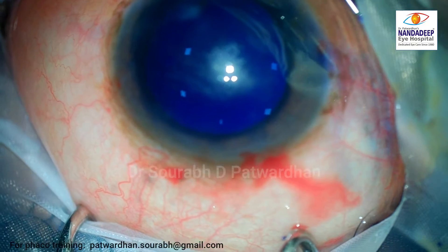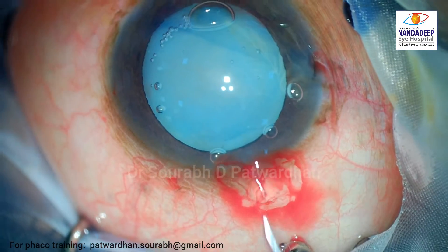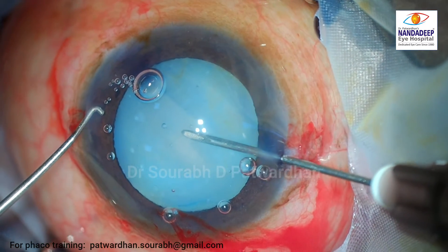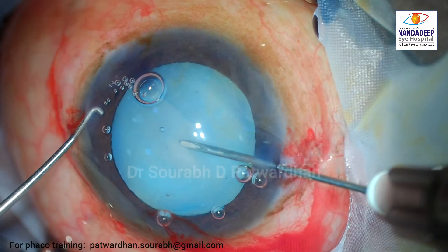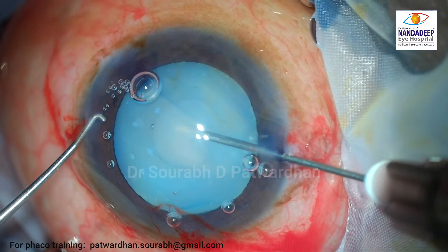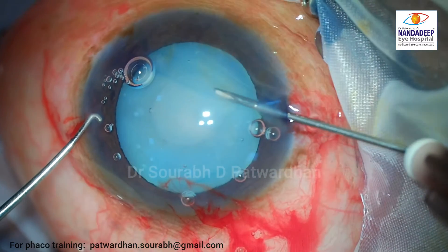As you can see here, the angle between the main incision and the left side port incision is around 100 degrees. Then the heavy viscoelastic agent Healon5 was injected in the anterior chamber to flatten the capsule.